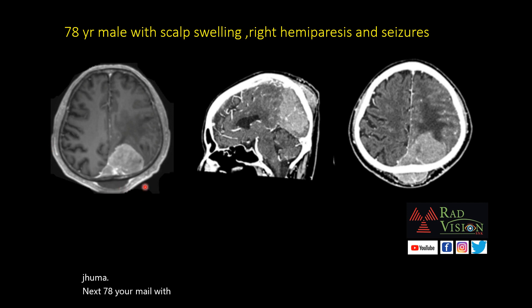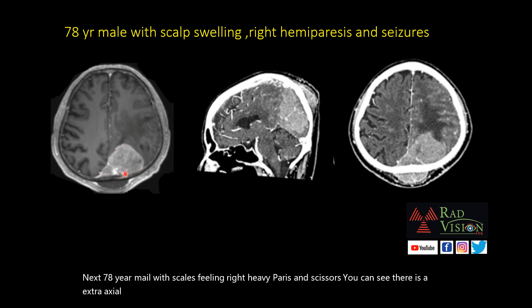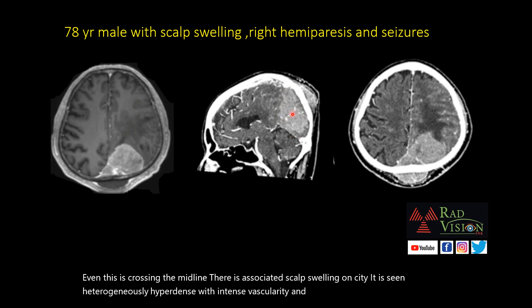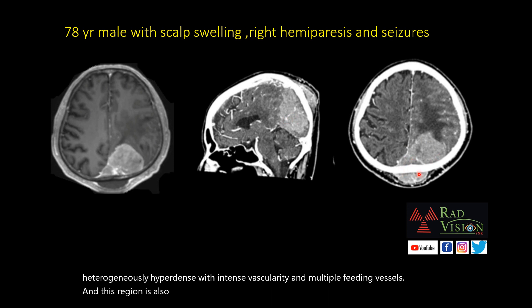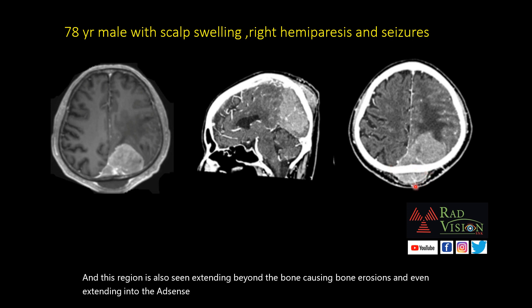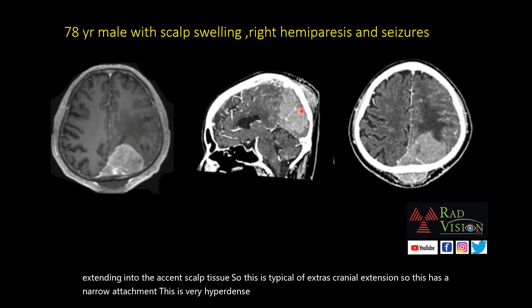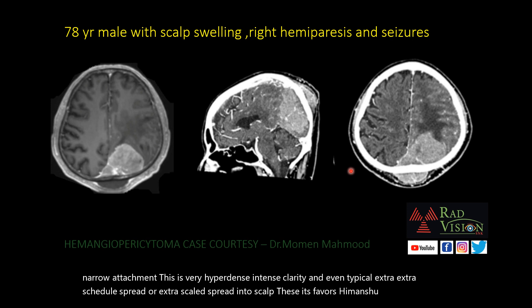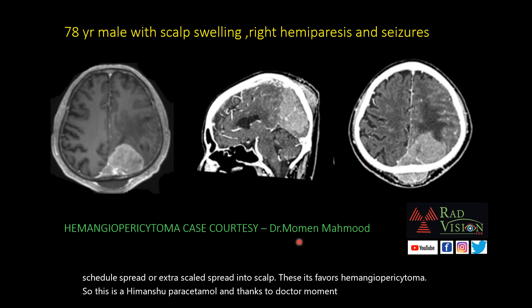Next case: a 78-year-old male with scalp swelling, right hemiparesis, and seizures. There is an extra-axial intensely heterogeneous enhancing mass lesion crossing the midline with associated scalp swelling. On CT, it is heterogeneously hyperdense with intense vascularity and multiple feeding vessels. The lesion extends beyond the bone, causing bony erosions and extending into the scalp tissue. This narrow attachment, hyperdensity, intense vascularity, and extra-cranial spread into the scalp favor hemangiopericytoma.